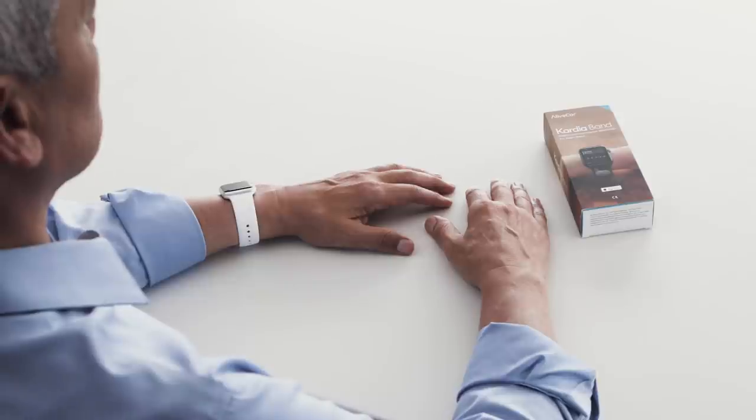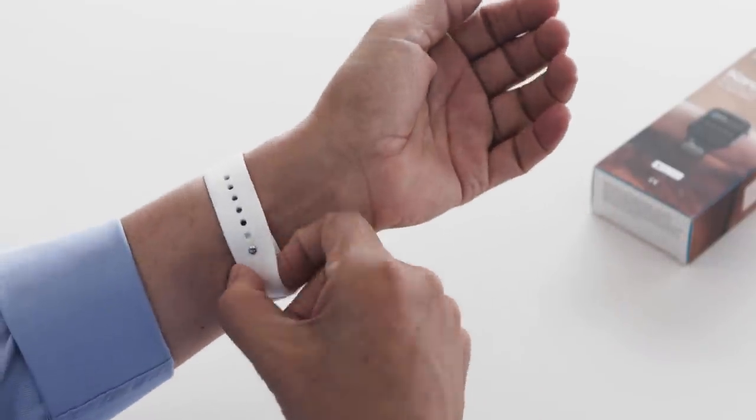Getting started. Welcome to CardioBand. Setup is easy, so this should just take a few minutes. Let's get started.